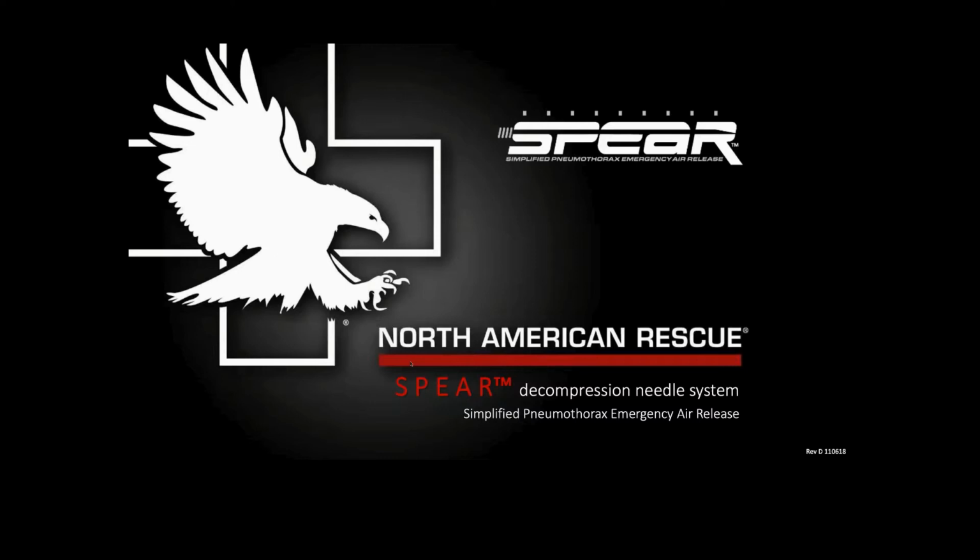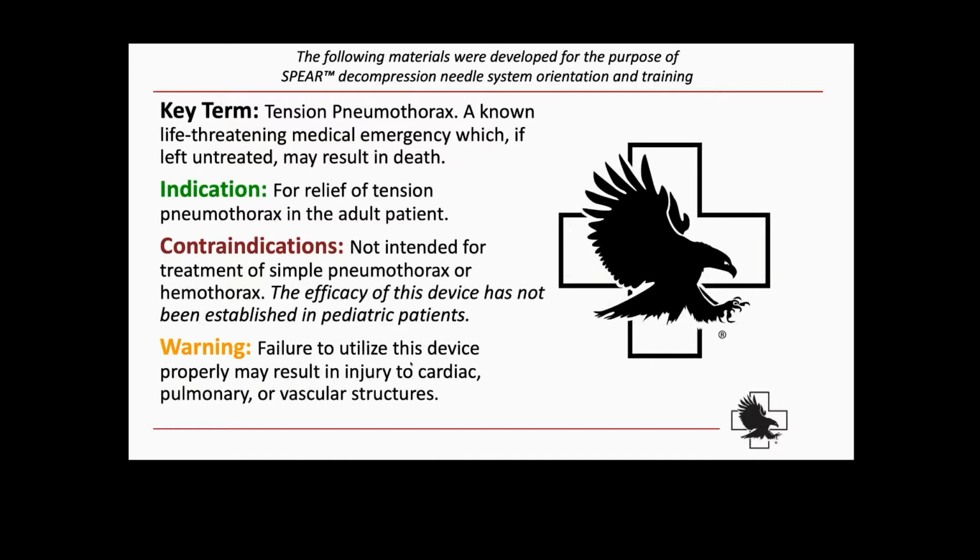With that said, North American Rescue makes this product, so we're going to utilize their slides that they put out publicly. This device is different, and there are some increased potential complications, and that's why it's worth us going through this in detail and talking about the difference in insertion and application of the device.